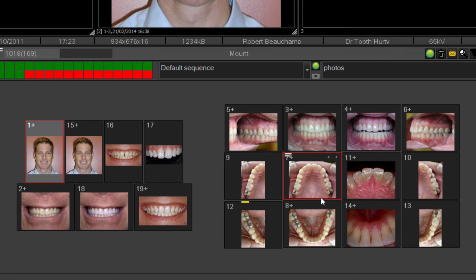But again, it will all be based on what images you want to acquire on patients, what type of anatomy you want to document, and how you want to use these images in the future for cosmetic simulations and whitening. So that's why we've added boxes here, which will allow you to take somebody's full face, modify it, and save them. And then you know that the patient has been enrolled for some form of cosmetic treatment, and you can keep them there and staff can stay on top of those treatment recommendations.